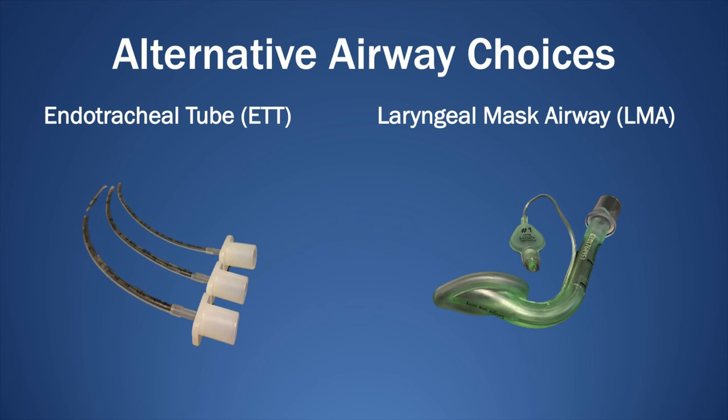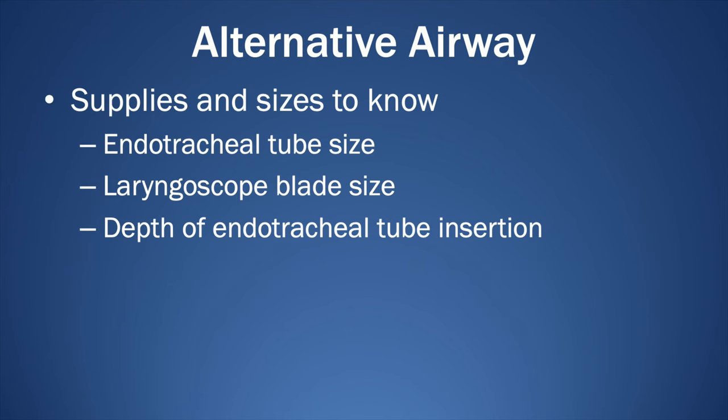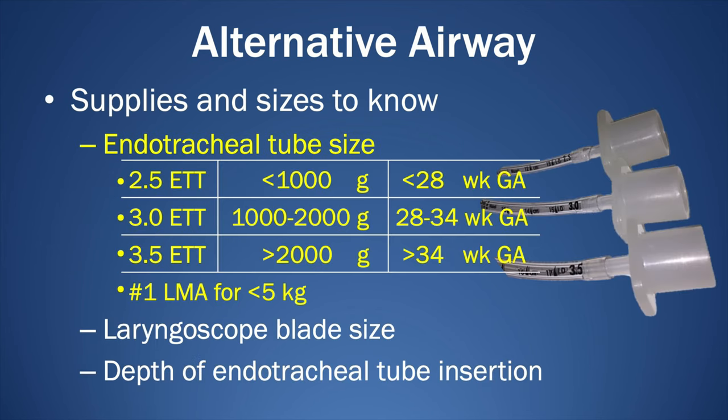An alternative airway may either be an endotracheal tube or a laryngeal mask airway. Everyone involved in the care of newborns should know the basic equipment, supplies, and measurements needed to successfully place an alternative airway. The correct endotracheal tube size is based on estimated weight or gestational age of the baby. 2.5 for less than 1,000 grams, 3.0 for 1,000 to 2,000 grams, and a 3.5 tube for greater than 2,000 grams. The LMA for newborns is a size 1 for most brands, though sizing is not standardized.